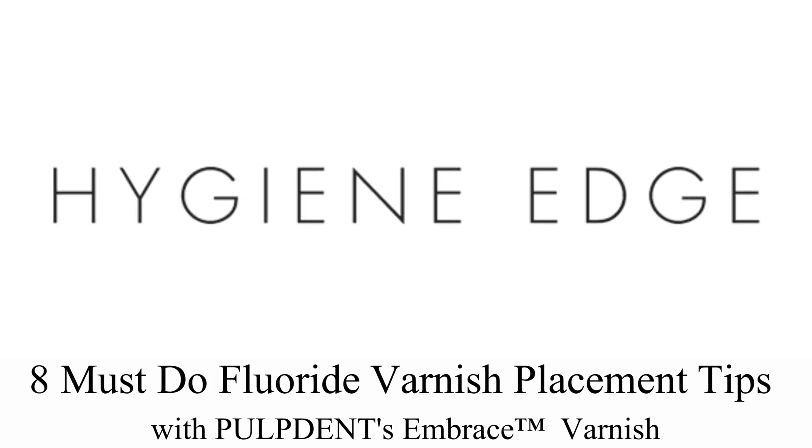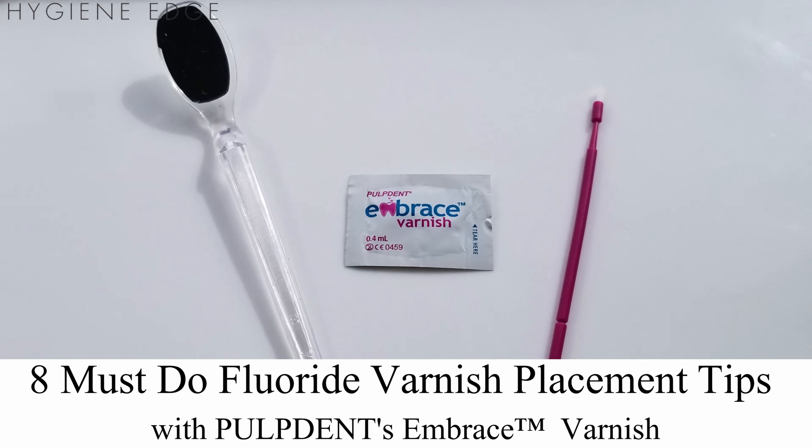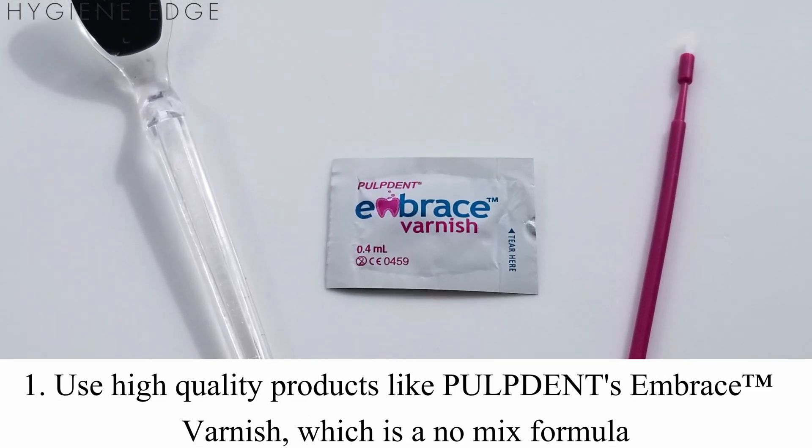Use high-quality products like Pulpdent's Embrace fluoride varnish that is combined with calcium and phosphate that becomes bioavailable for uptake into the tooth as you place the varnish. It's a time-saving no-mix formula.